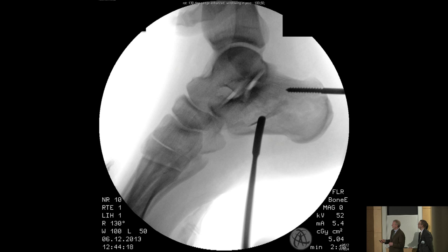You can see that this patient started out in a little bit of a cavus configuration, so you have to tuck the top of the tuber in and then place fixation across that fracture line, which is going in this angle. And the anterior process had to be secured so that this screw would have something to bite into.